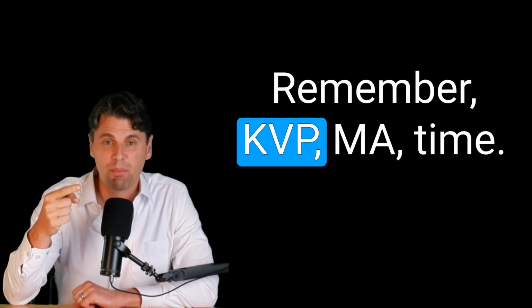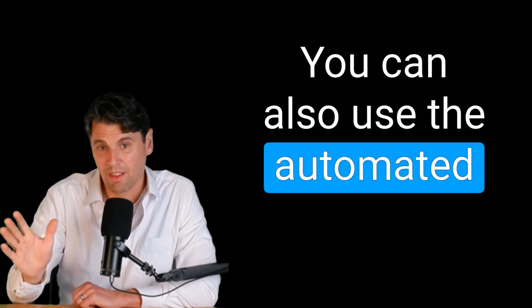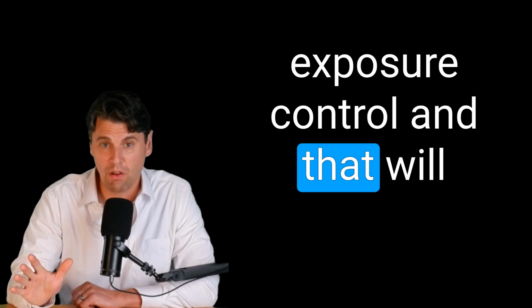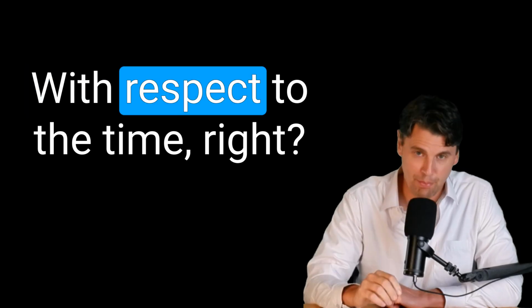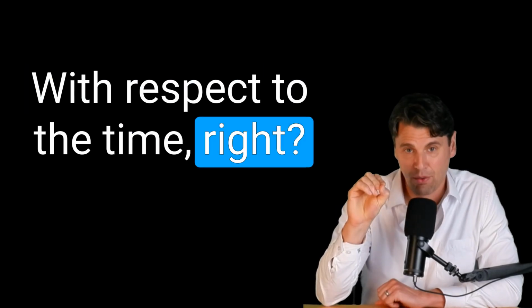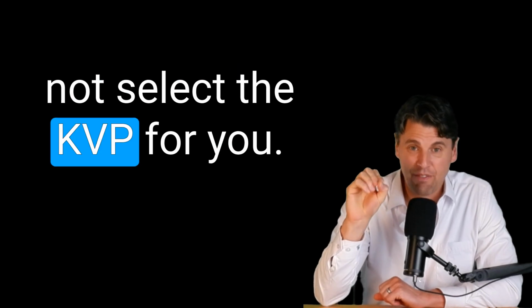Remember, KVP, mA, time. You can also use the automated exposure control, and that will actually select the exposure with respect to the time, right? The automated exposure control does not select the KVP for you.